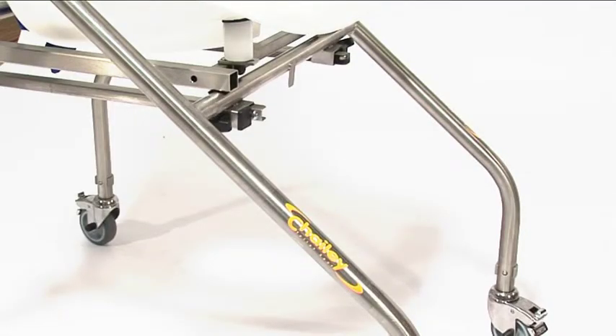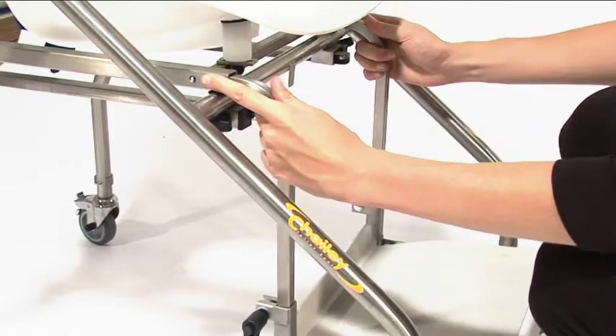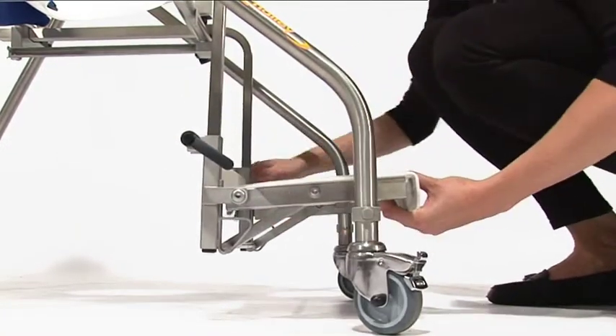To attach the footrest, insert the footrest tubes into the ends of the frame tube until the bottom clips locate securely. The footrest height is adjusted using the clamping levers on either side of the footplate.